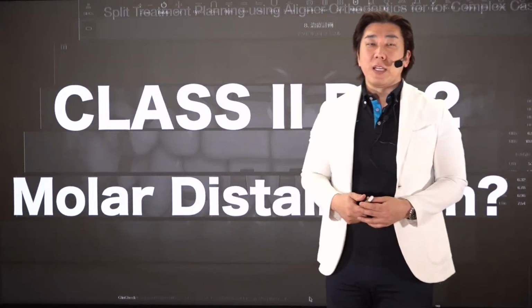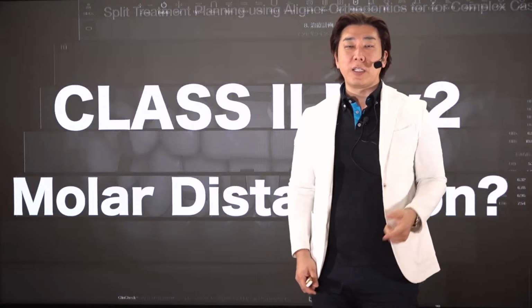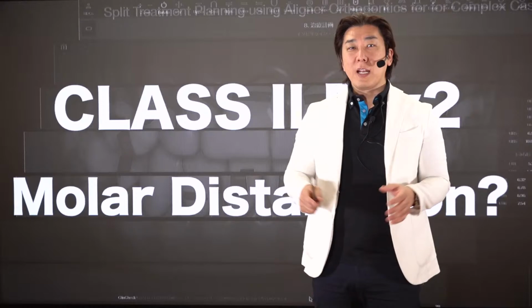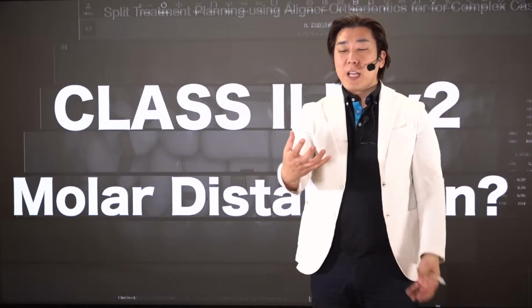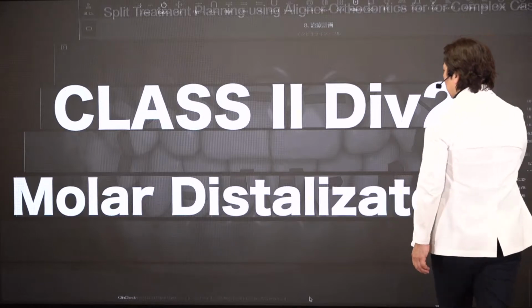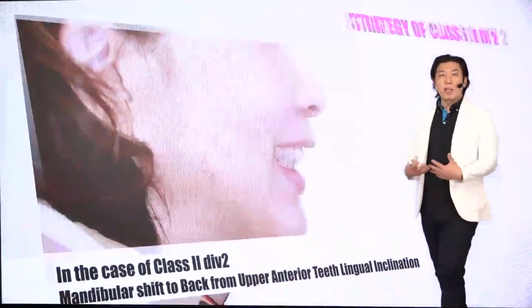Please have an image. Multi-bracket braces and lingual braces work on only one aspect, the labial side or the lingual side. But the aligner grips all surfaces, then slightly moves the distance. That is amazing. This is the new approach. Then, is class 2 division 2 molar distalization simply planned or not?